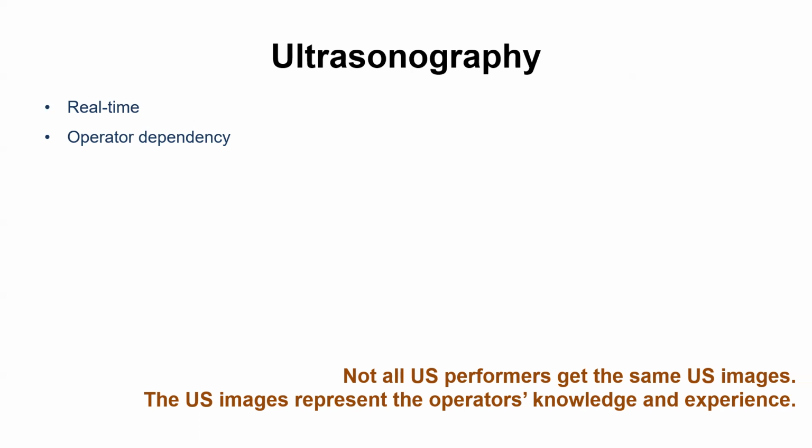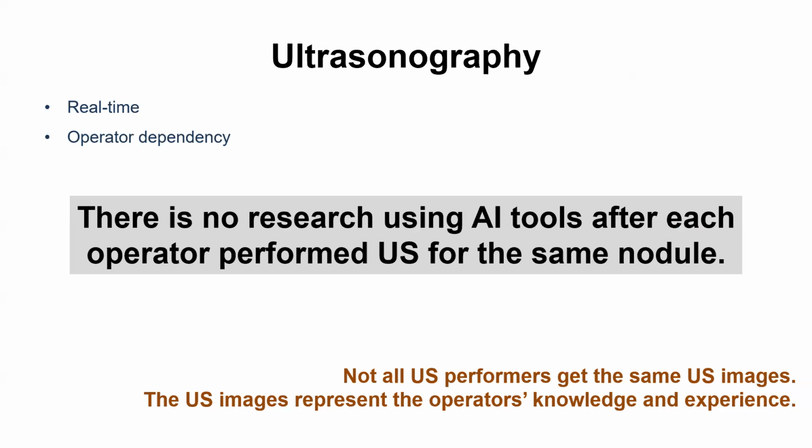As far as I know, all studies on AI tools have used static images for diagnosing thyroid nodules on ultrasound. There is no research using AI tools after each operator performed ultrasound for the same nodule.